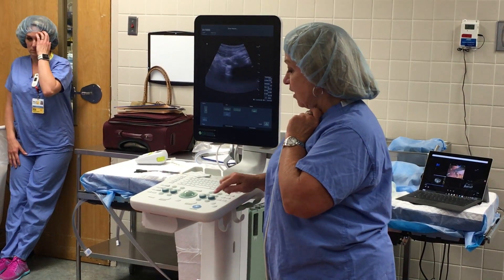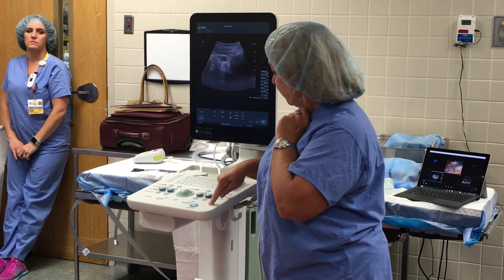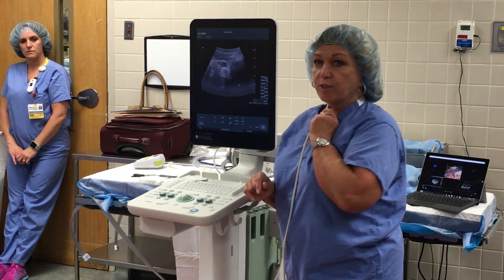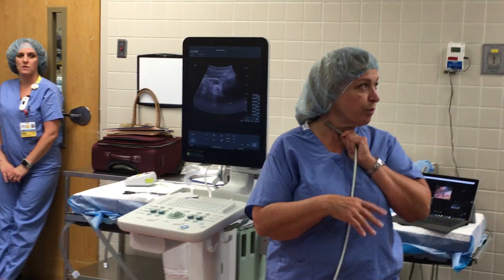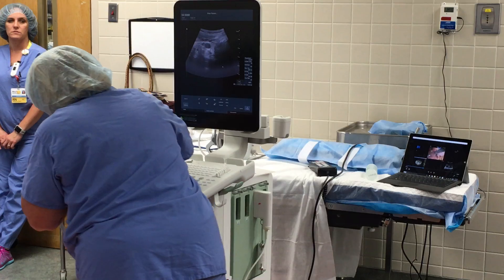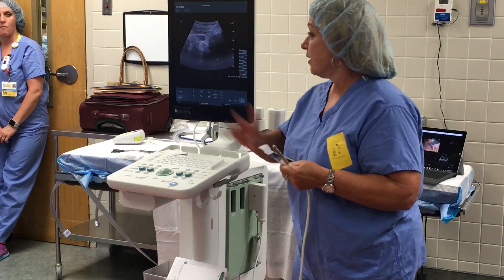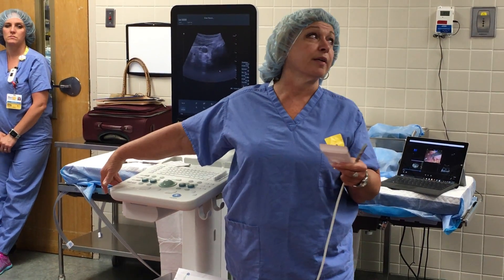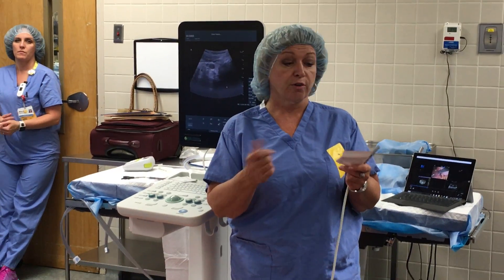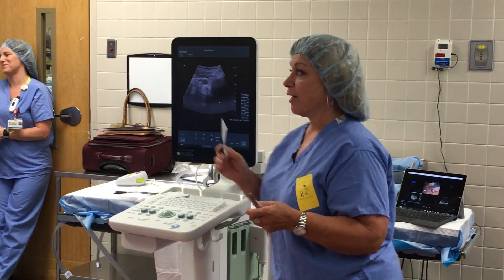They should not be labeling these machines themselves. If you want to freeze it, you freeze it, and you can print it here — it usually takes a picture up there too, but I didn't put any information in. Now you've got your picture to print out. In California I've taken the images, put them on a USB drive and put them in Epic — we're going to try that here to see if it works. I've laminated instructions for how to do that, or else you can just scan it and put it in the chart.